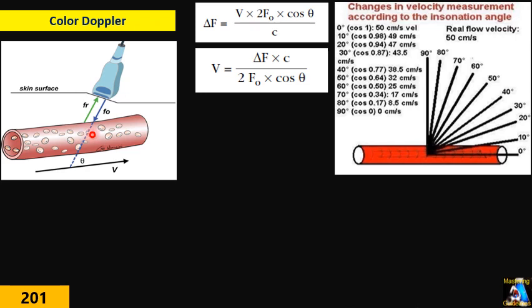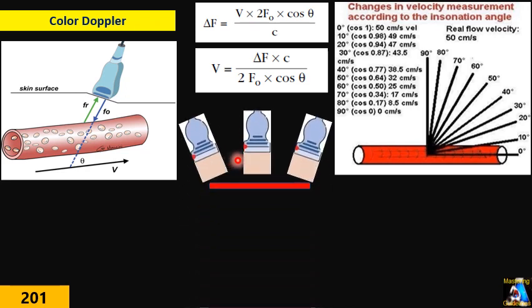For fixing this problem, we have two options. One option is the probe maneuver. As you know, one of the maneuvers for the probe is rocking or heel-toeing. Here we have a rocking shape of the probe when we do rocking.